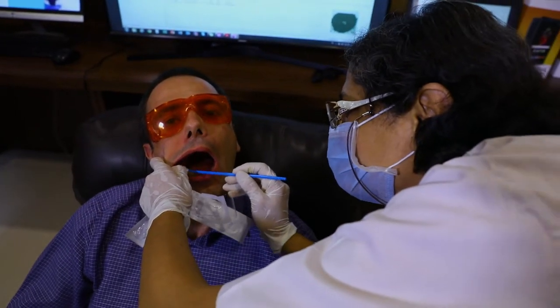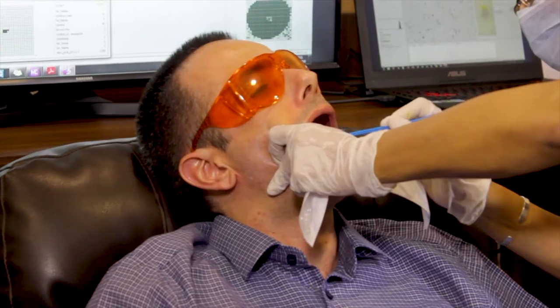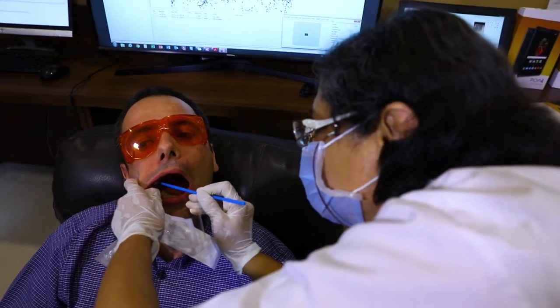The area that is blackish on the Wellscope — I am scraping that with the brush. There is no blood and there is no discomfort to the patient.